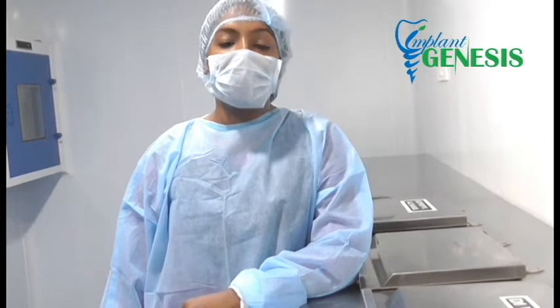In order to maintain every process and every feature, we do regular validation procedures. Here we do our best in the manufacturing part to support the rest of the process, helping in a long-lasting smile on every patient approaching us.